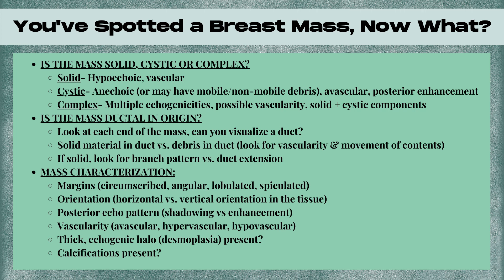The next thing to determine is whether the mass is ductal in origin. Carefully look at each end of the mass — can you visualize any milk duct coming off the end? If so, carefully scrutinize to determine if this is solid material or debris within the duct. Look for vascularity and any movement of the contents — this helps you determine if it's just debris in a segment of duct or a true mass. If it's solid, look for branch pattern and duct extension, which we'll go over in a minute.